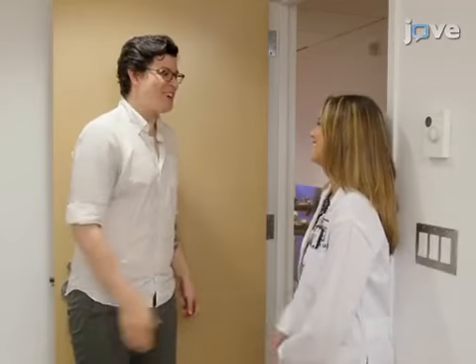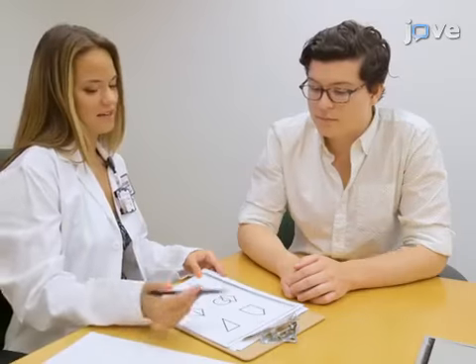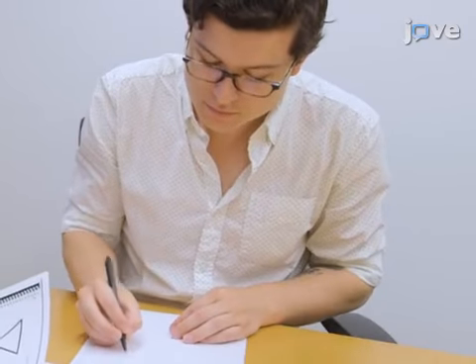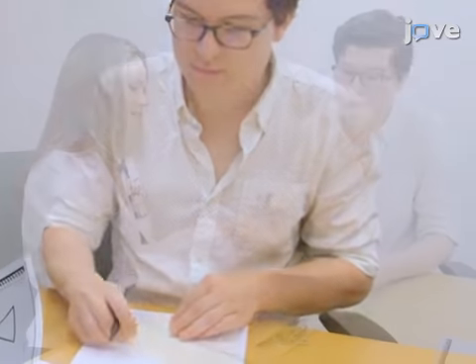At baseline, begin by escorting the participant into the testing room. Administer relevant neuropsychological assessments based on the patient population to assess motor and cognitive abilities of the participant that will serve as screening and outcome measures.